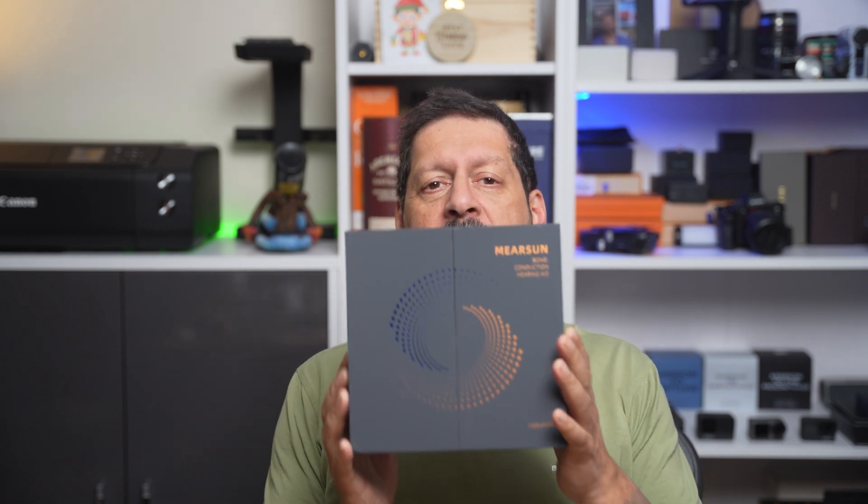Have you ever wondered what the future of hearing aids might look like? Recently I've been testing a bunch of different hearing aids, mainly over-the-counter ones, but nothing quite like these. These are the Mearsun bone conducting hearing aids, and it's definitely an exciting new development in the world of auditory technology. Stick around as we explore how this device is changing the game for people with hearing loss.